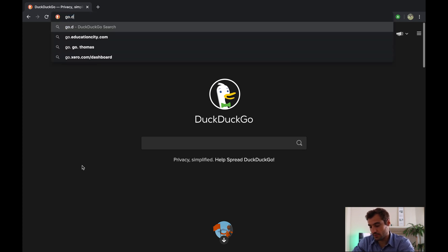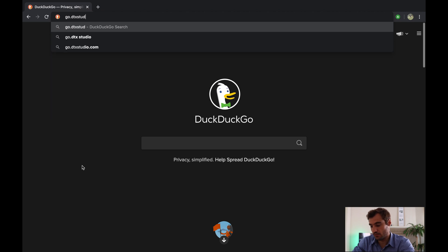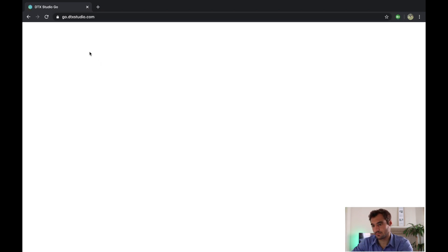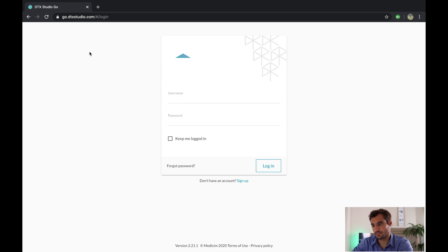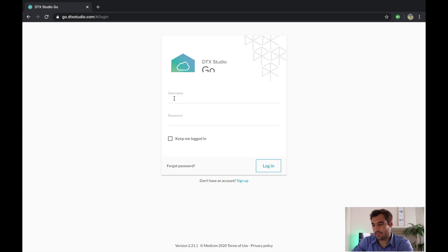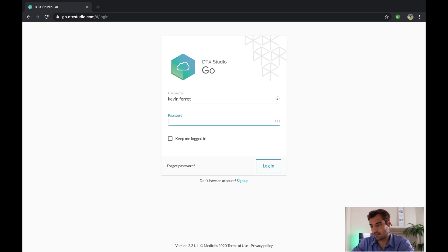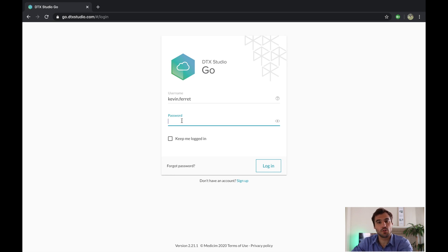go.DTXstudio.com. Alright guys, once on the website, just enter your credentials. So your username is most of the time your first name dot your last name, and your password. If you don't remember it, it's fine.